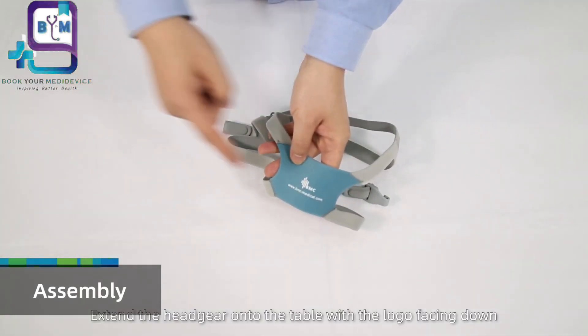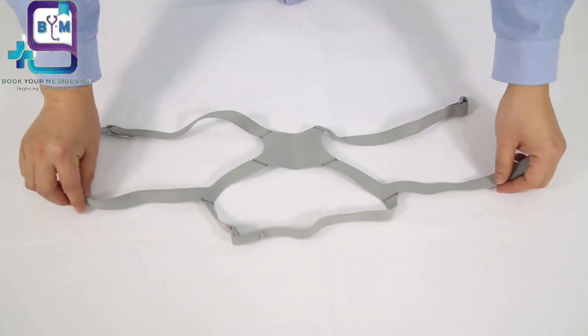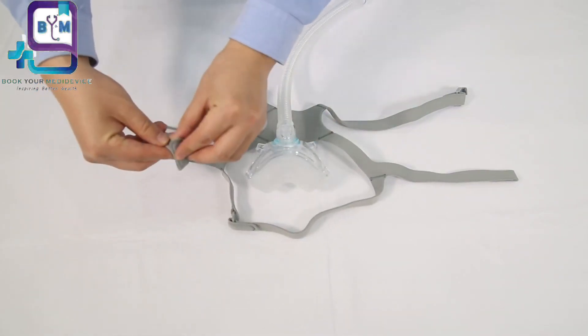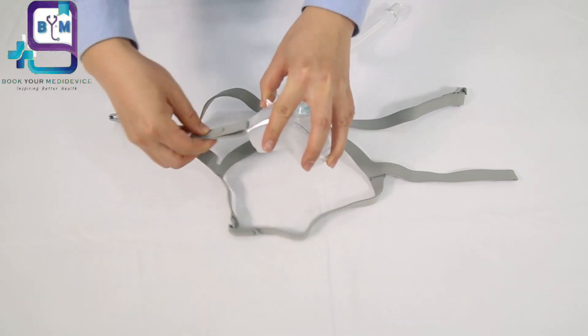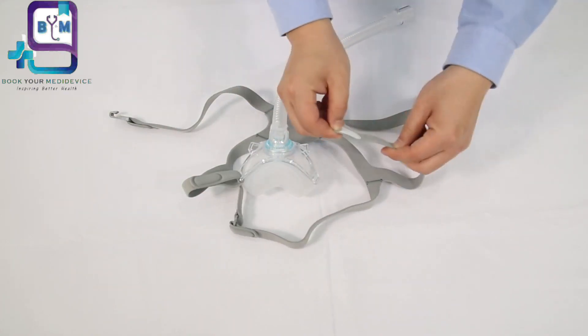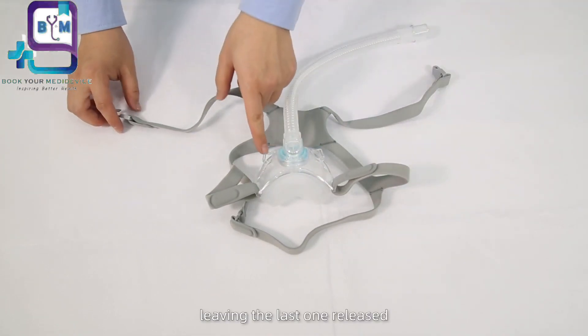Extend the headgear onto the table with the logo facing down. Put the mask body onto the headgear and connect the mask with three points of the headgear, leaving the last one released.